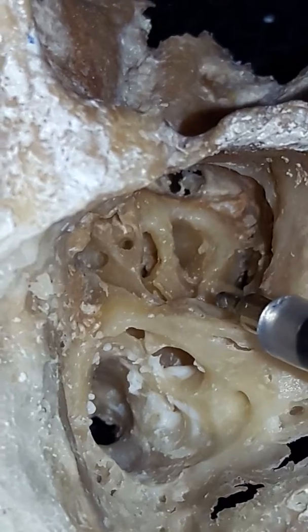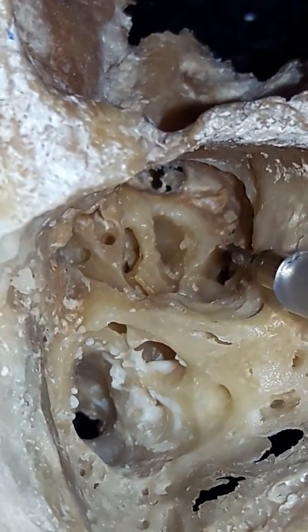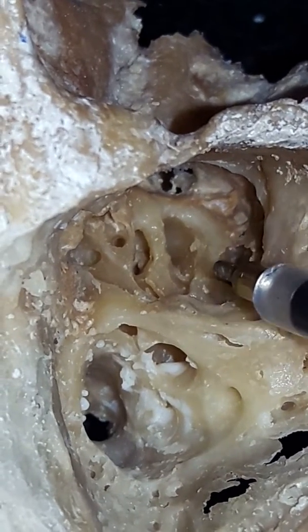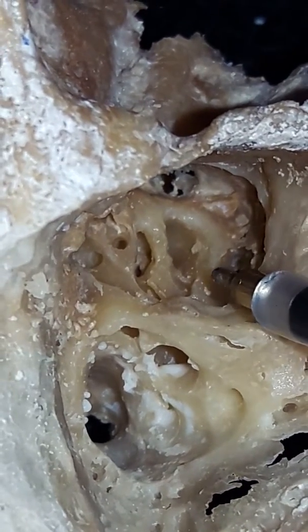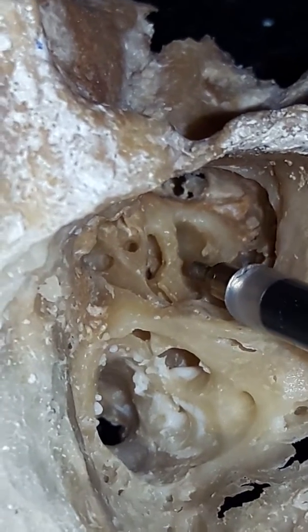One is the fustis, this is the fustis here, and when you drill the hypotympanic cells, you identify the ivory bone of the outer wall of the cochlea. This is the outer wall of the cochlea, OWC. So then if you make a cochleostomy, that leads to scala tympani.